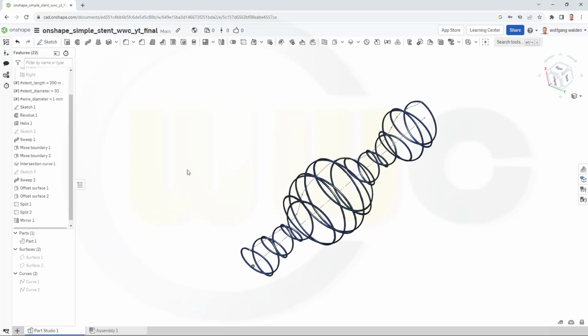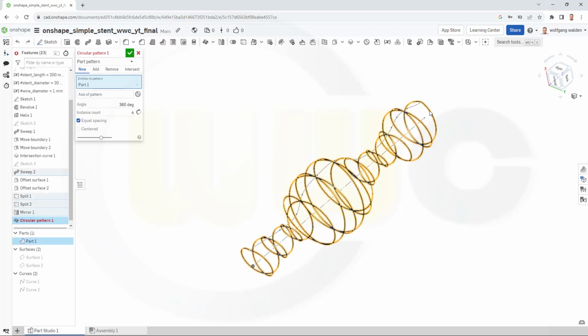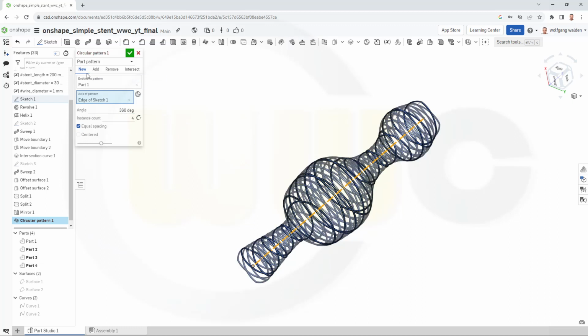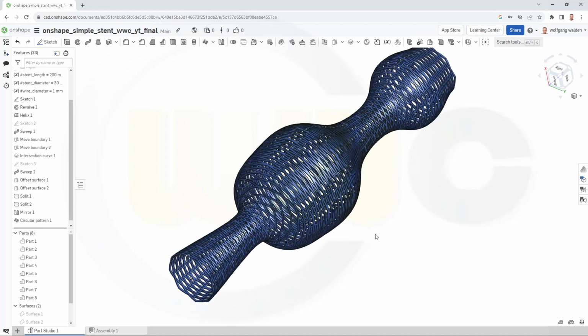Now let's go for a circular pattern. Yes, again a part pattern, the axis, so I want to pattern both parts, this one, and the axis of pattern would be this here, equal spacing, let's go for 8 instances. And confirm. And I'm done.